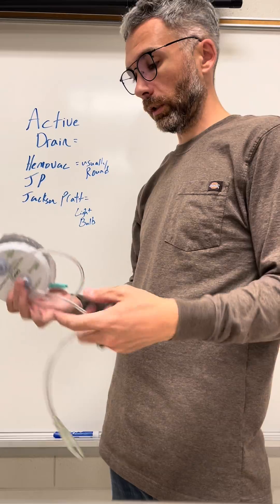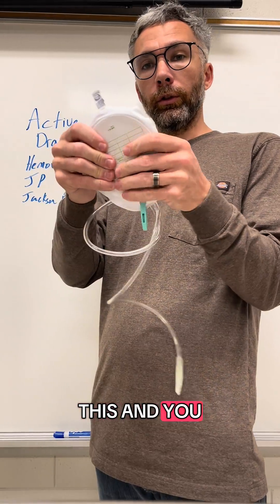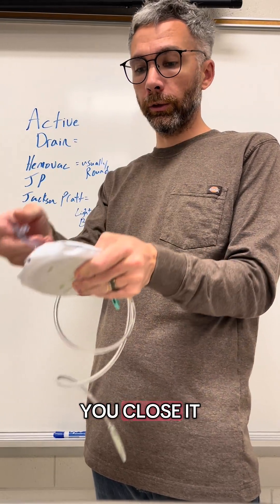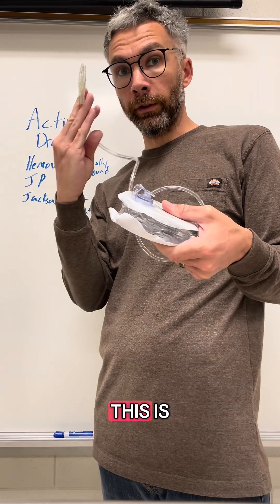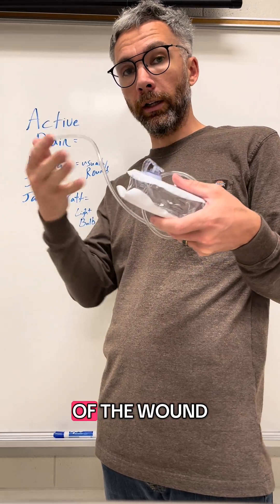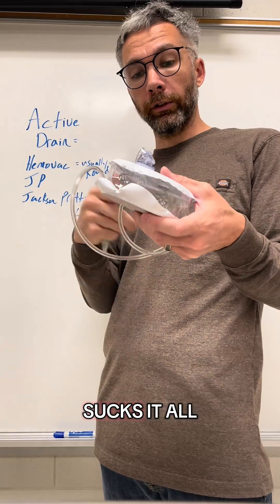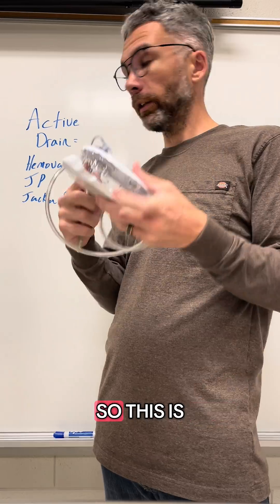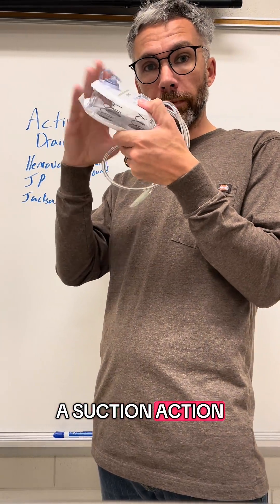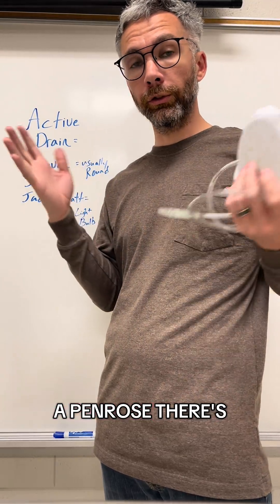Same thing with this disc — you squeeze it and close it, and the springs want to push it back open. When it does, it pulls fluid out of the wound, sucks it all the way through the tubing, and draws it into the reservoir. So this is active — it has a suction action.